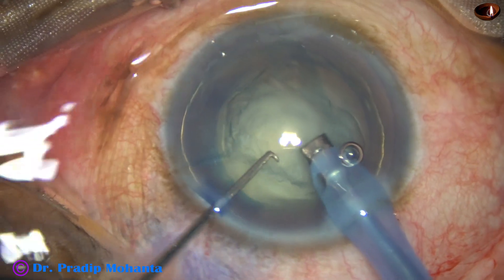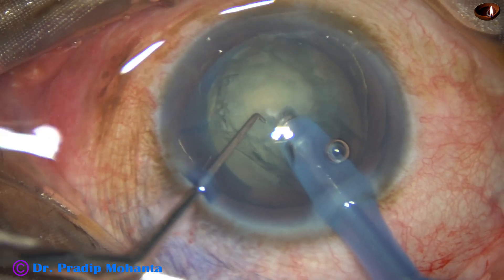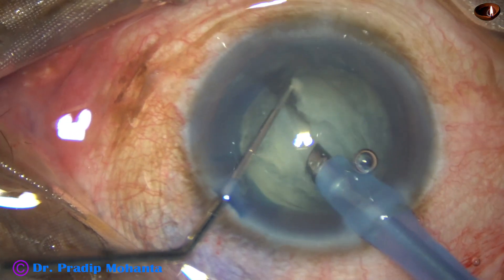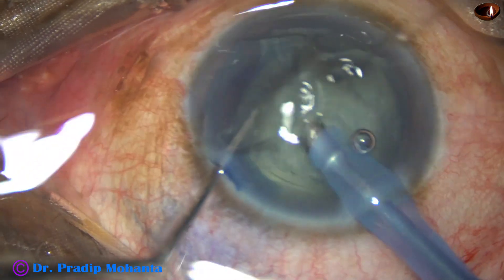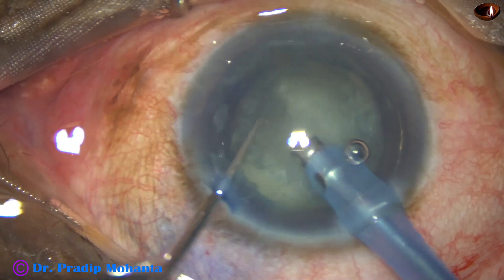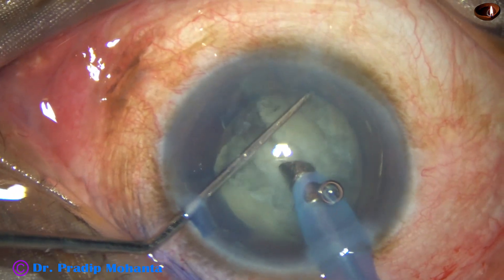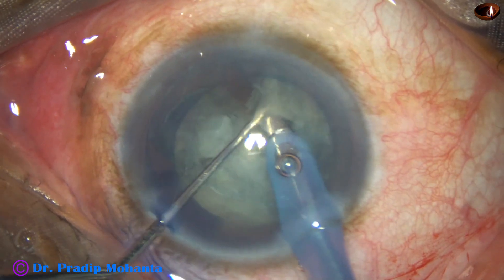Some superficial lens matter is removed. This is a direct chop. The handpiece is turned towards 3 o'clock for another chop, and this free nuclear fragment is emulsified. Now the handpiece is turned towards 7 o'clock, and one more piece is made free.